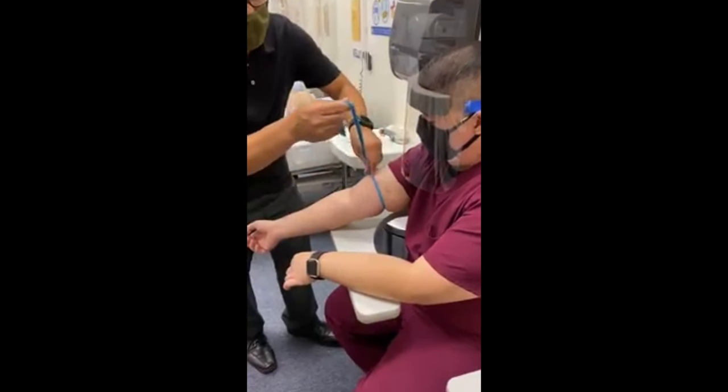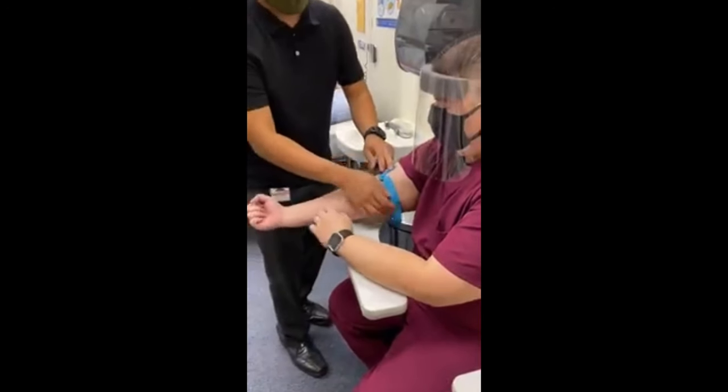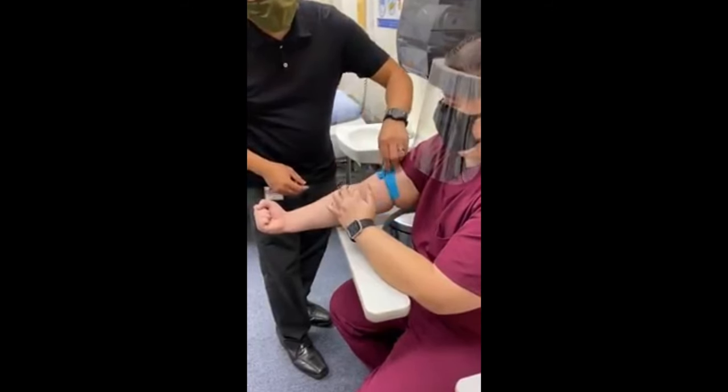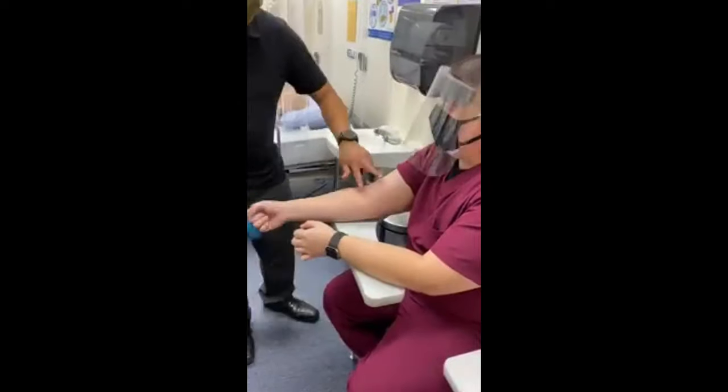Yeah, pulling this way. And then he tucks it in. Because you'll have a short and long end, so you'll know what to pull. You don't want to pull this one, you want to pull this one, it's easier. Okay. So you pull it out easy. Okay, so just remember 3 or 4 inches.